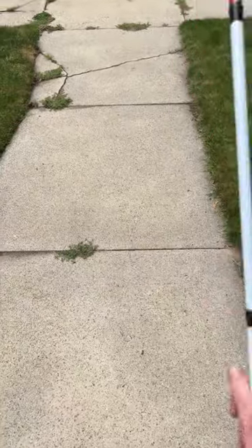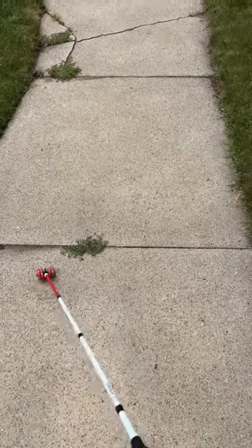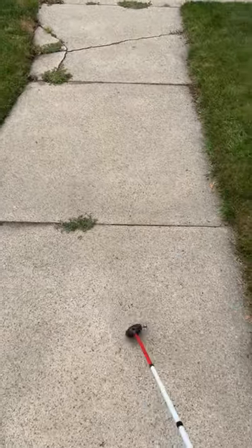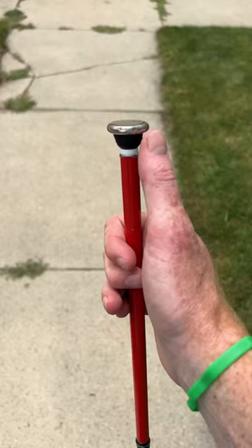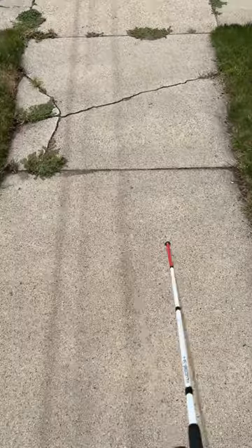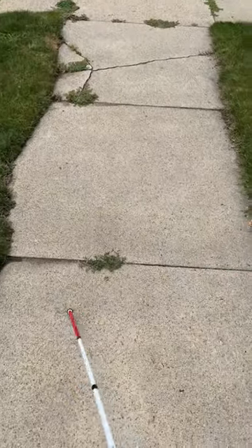This is a short demo of the many different types of cane tips that are available for somebody who's blind or visually impaired. First one here is an omnisense cane tip. Here we have a rover freewheeling cane tip. Next here is a metal glide cane tip. Here we have a ceramic cane tip.